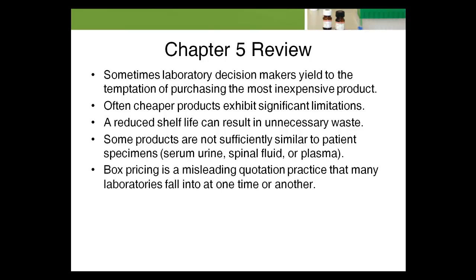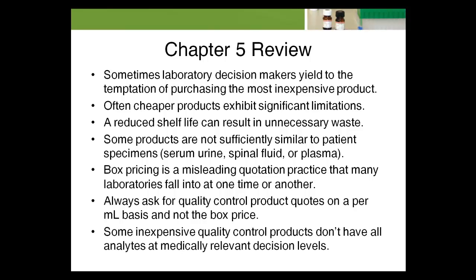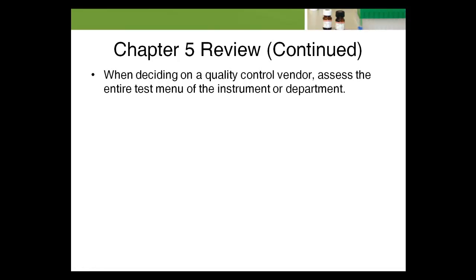Box pricing is a misleading quotation practice that many laboratories fall into at one time or another. Always ask for quality control product quotes on a per milliliter basis and not the box price. Some inexpensive quality control products don't have all analytes at medically relevant decision levels. When deciding on a quality control vendor, assess the entire test menu of the instrument or department.